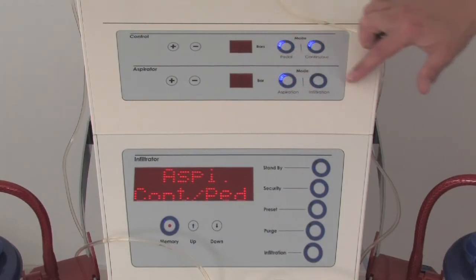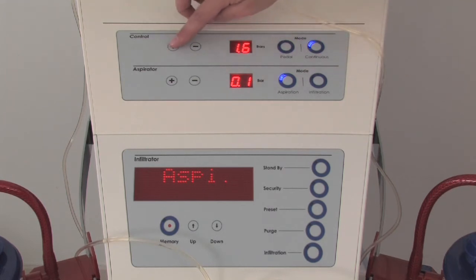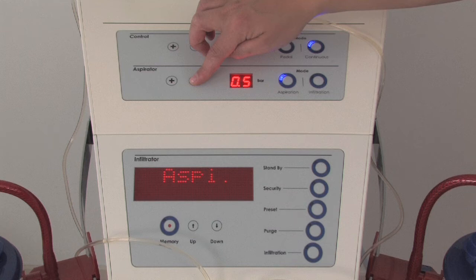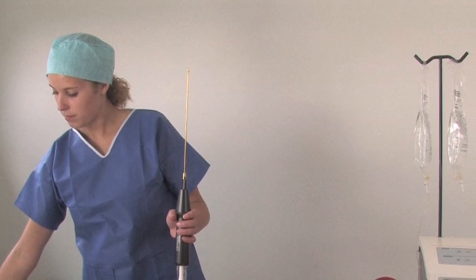Select the aspiration mode button. Select the pedal or continuous mode. Adjust the air pressure. The recommended pressure for aspiration is between 2 and 5 bars. Set the air vacuum. Push on minus to increase the air vacuum. The minimal air vacuum is minus 0.1 bar and the maximal one is minus 0.9 bar. The system is ready to start the liposuction.